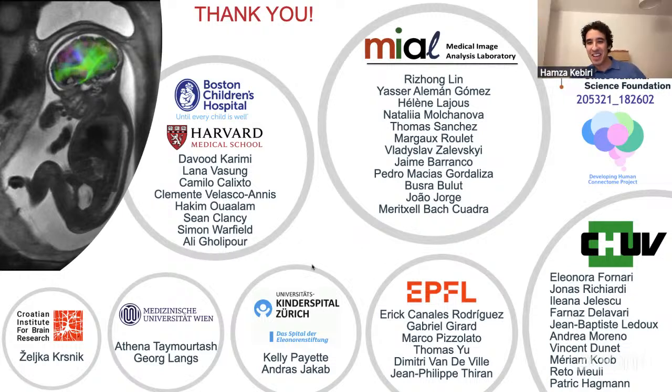Yeah, sorry. So this is kind of the standard way to do it in diffusion MRI, because it's a signal on a sphere. And this spherical harmonic decomposition is the best mathematical representation that you can use later to manipulate these mathematical objects. This is very much detailed in the thesis of Maxime Descoteaux, Descoteaux in 2008. The answer is that it's a spherical signal, so you have different gradient directions, and this is the best way to basically represent it.